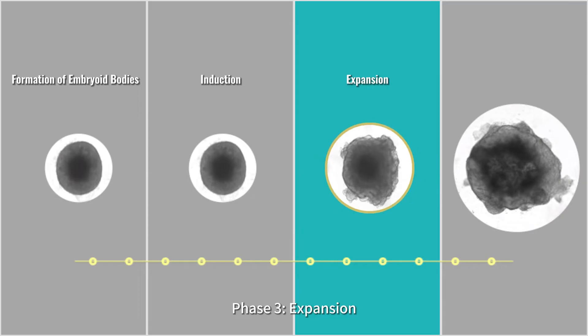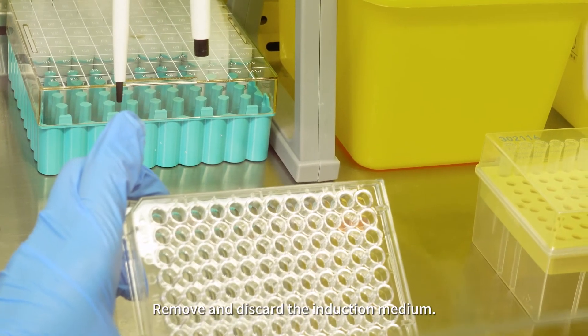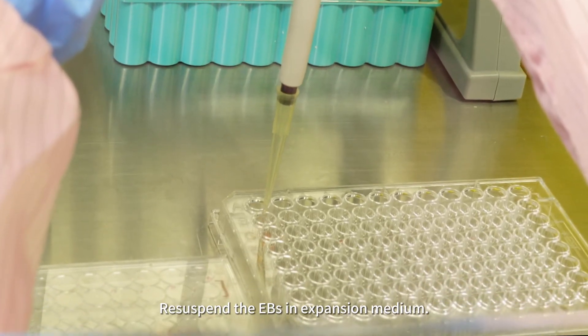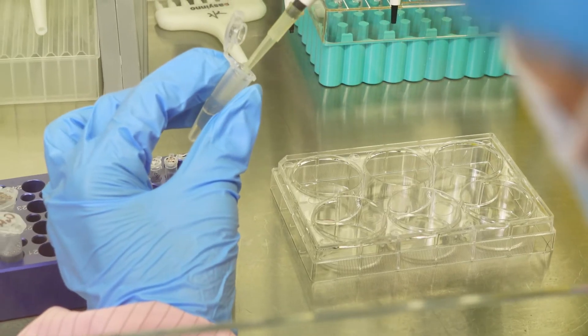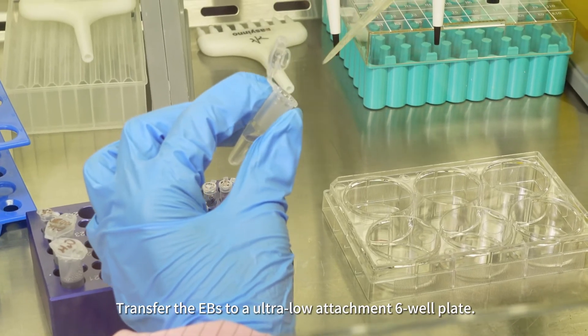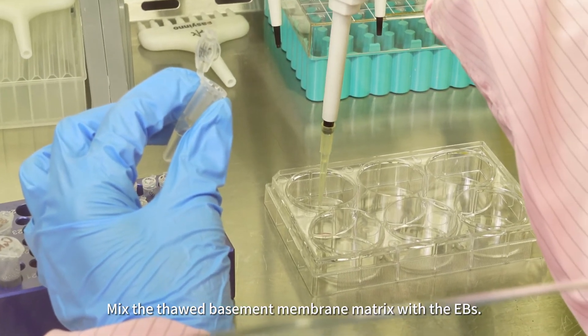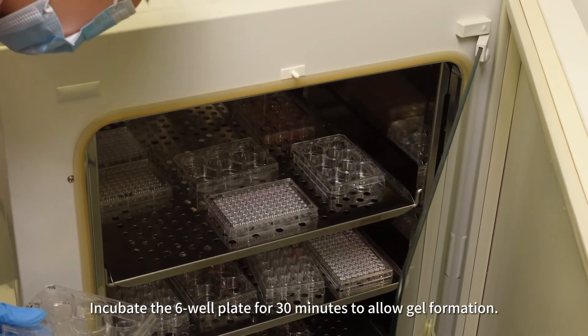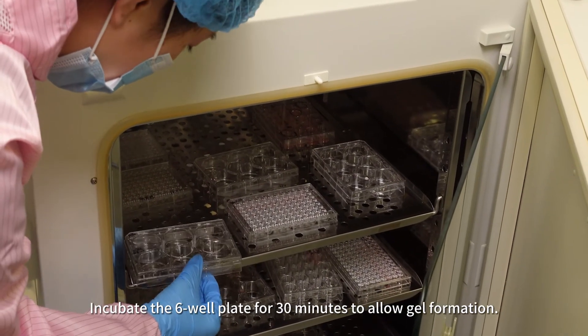Phase 3, Expansion. Remove and discard the induction medium. Resuspend the EBs in expansion medium. Transfer the EBs to an ultra-low attachment 6-well plate. Mix the thawed basement membrane matrix with the EBs. Incubate the 6-well plate for 30 minutes to allow gel formation.